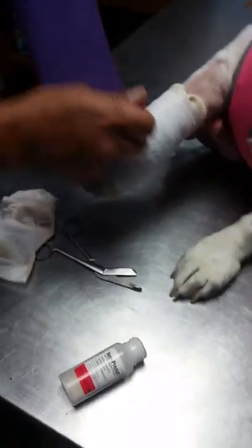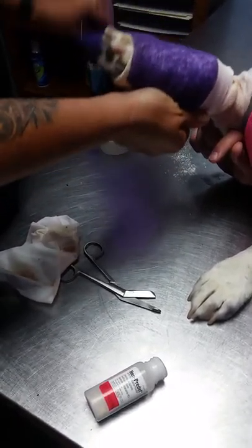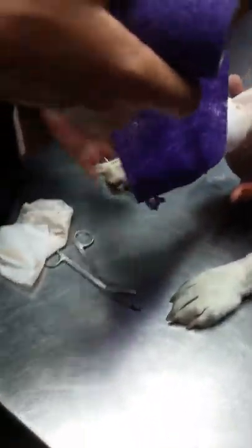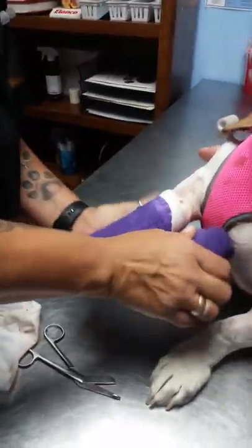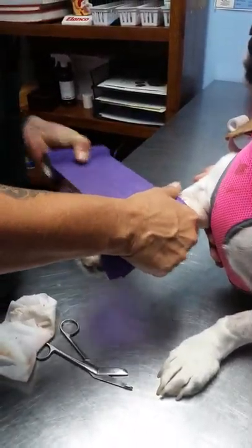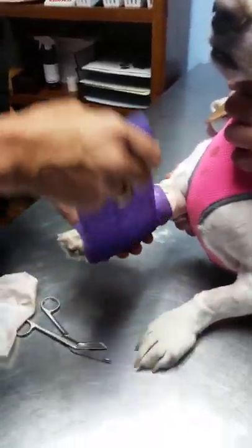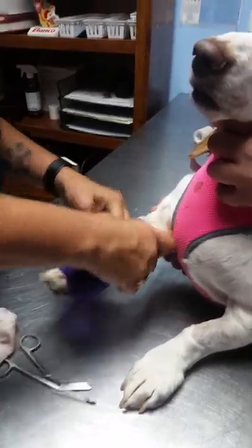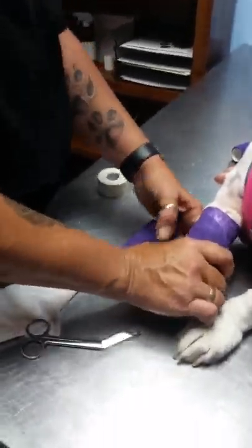Go ahead and take your vet wrap and pull it off before applying, just so it doesn't apply too much tightness. See how it's elastic and goes back on you — you don't want that to happen. It's easier if you cut it smaller rather than using half of it. They make these things called scissors.